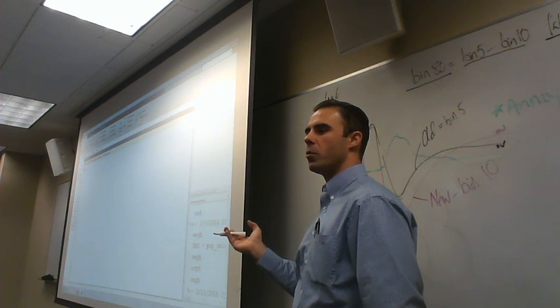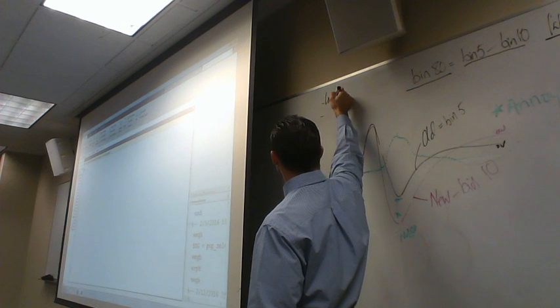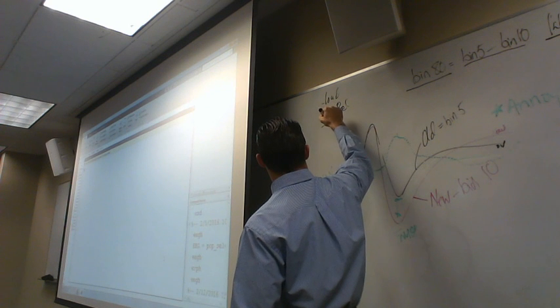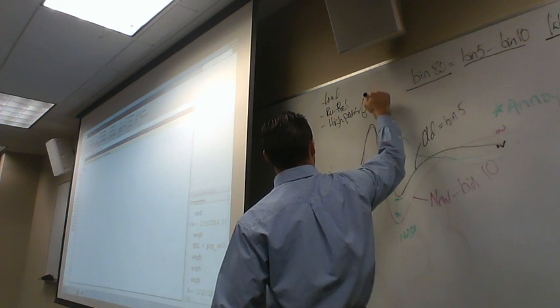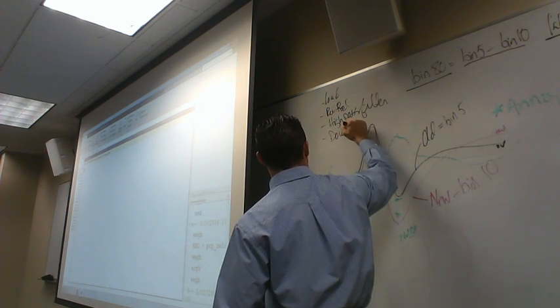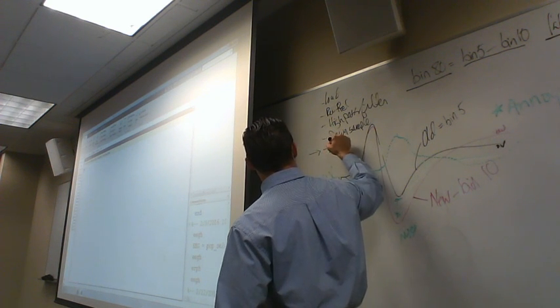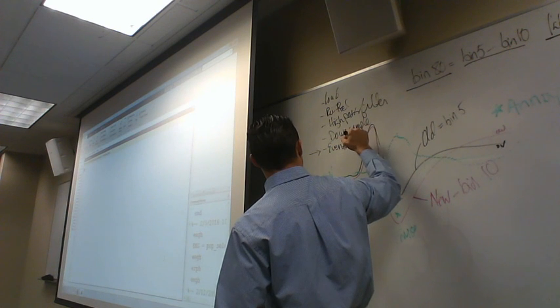What do we do basically? So we had our order of operations. We loaded the data in. We already loaded it such that we had re-referenced. We did the high pass filter. Then we did our downsample. What happened after that? What was our next step? Event list? Okay, yeah. So here we did our event list.